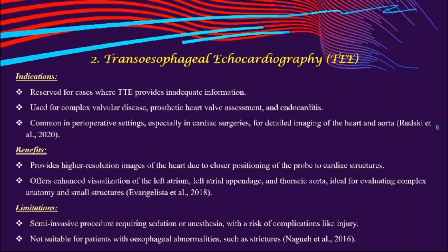TEE, transesophageal echocardiography. Indications. Reserved for cases where TTE provides inadequate information. Used for complex valvular disease, prosthetic heart valve assessment, and endocarditis. Common in perioperative settings, especially in cardiac surgeries for detailed imaging of the heart and aorta.